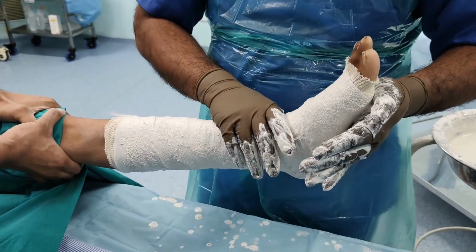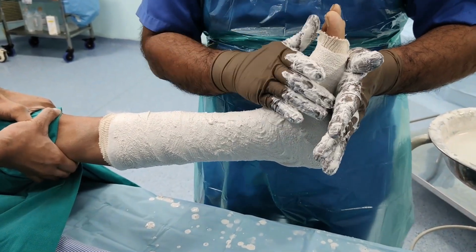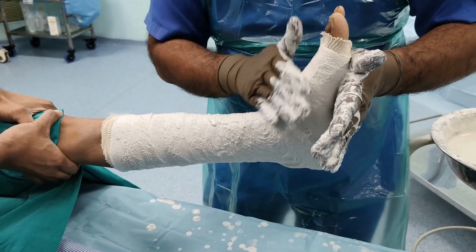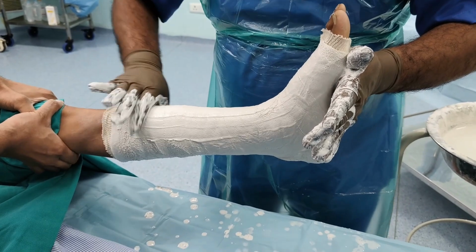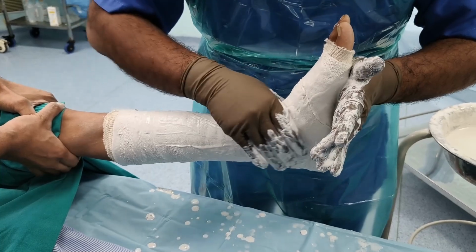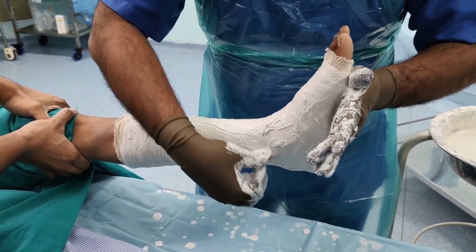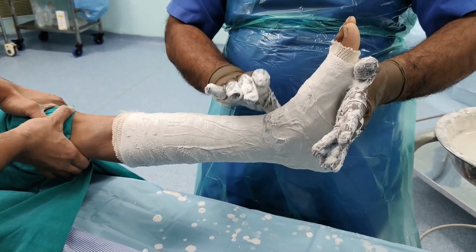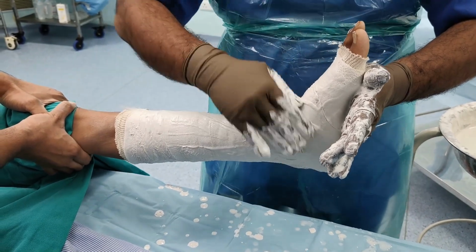So I gently, using my palms, without pressing with the fingers, just press with the palm, and again smoothen it out, and again mold it around the bony prominences. I am molding it around the medial malleolus, again along the lateral malleolus, and the tendo-Achilles. The same procedure is repeated.